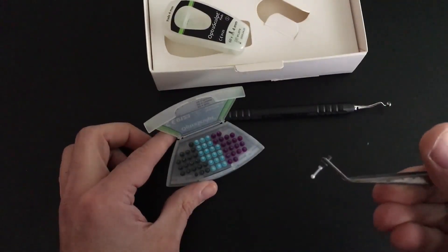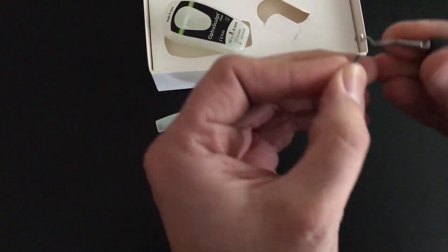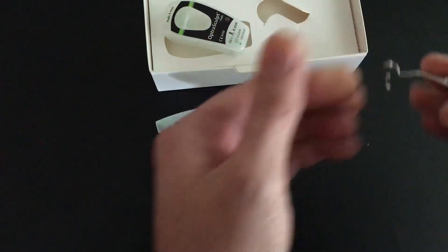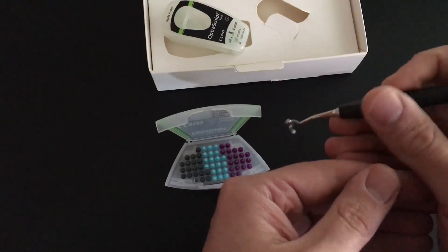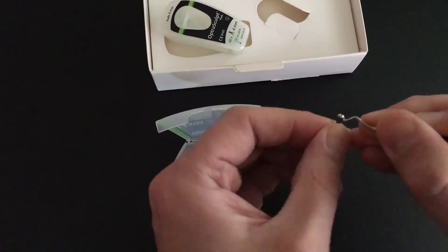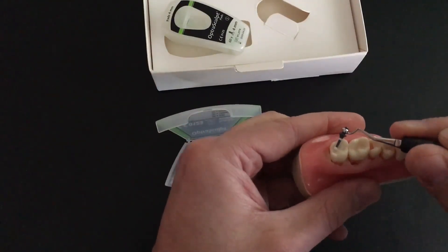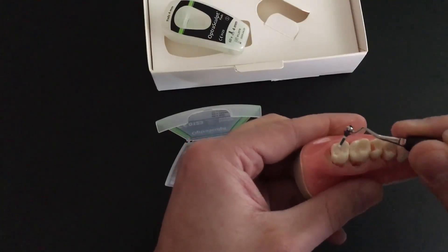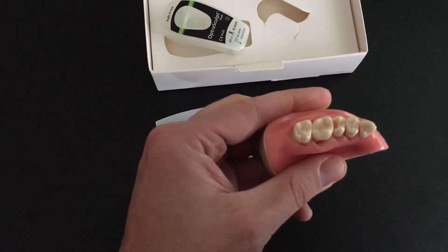Here is the ball tip. These are Teflon-coated, and you can put this either direction on the instrument, depending on what's going to work better for what you're trying to do. If you're trying to get back behind on a number 2 or 15 and sculpt from the lingual, that works really well. You can really see how that little ball may help you sculpt and carve some occlusal anatomy.